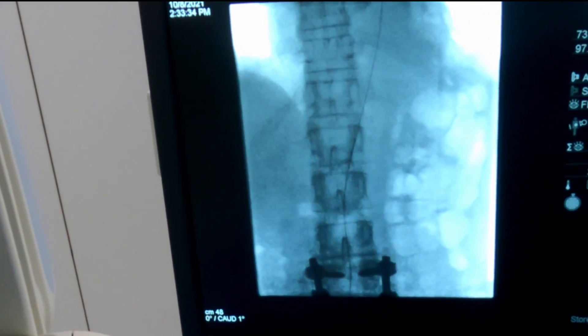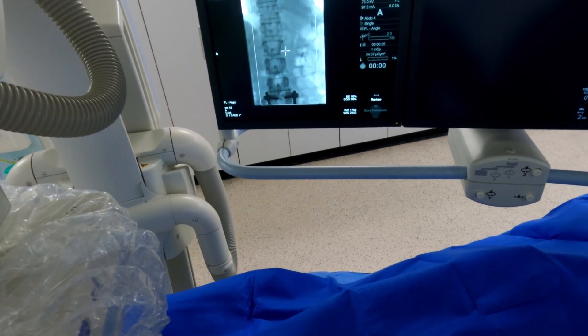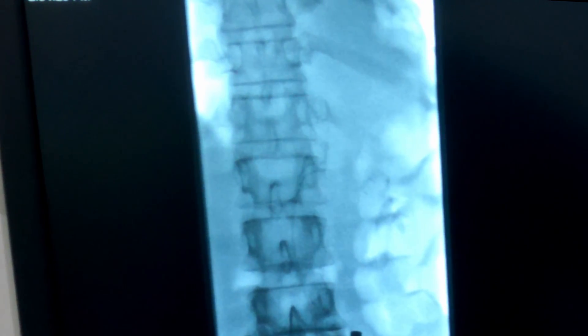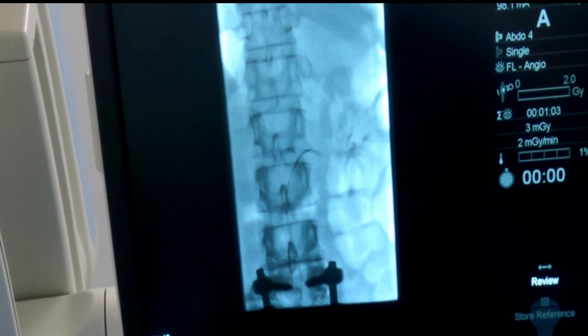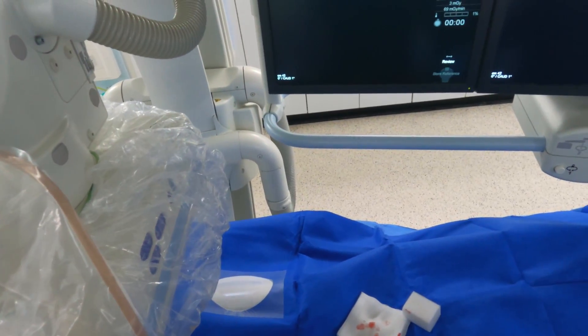I'm going to take this up to about L2 — that's fine. I'll take the wire out and then pull it down to try and engage that left renal artery. We're just going to hook it into that left renal artery. We'll leave it about there. Can we go mag one please? Hold it there nice and still — don't breathe, don't move.